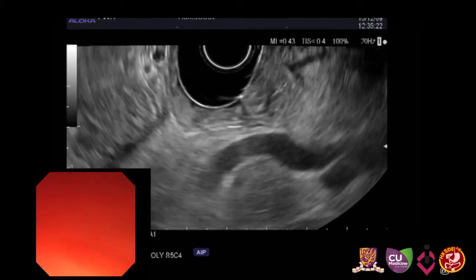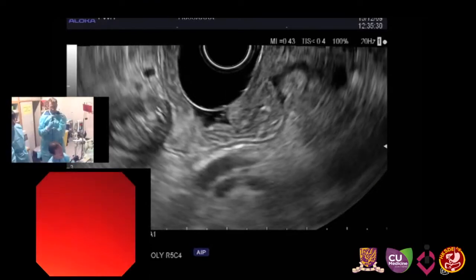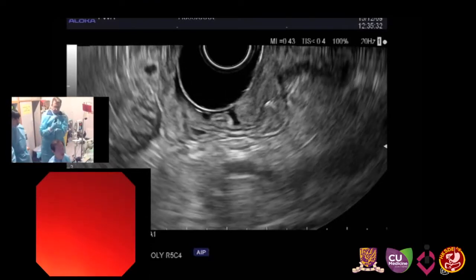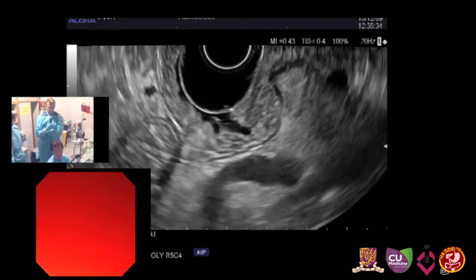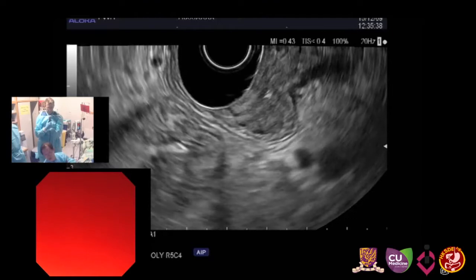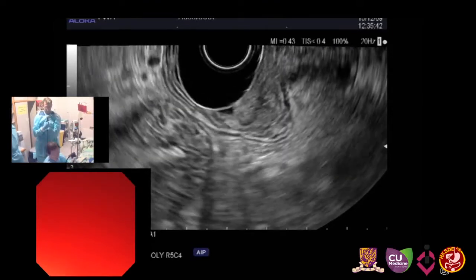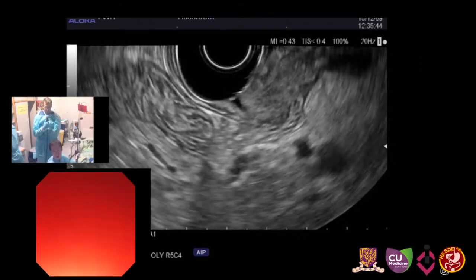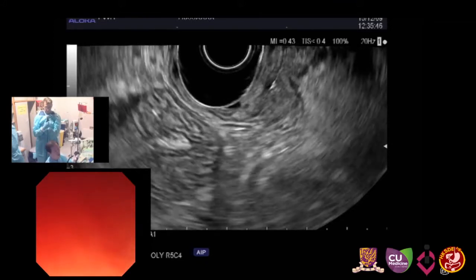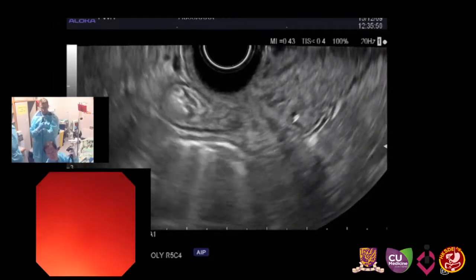Okay. Is there any question or comment on the evaluation of this lesion? Yeah, I think okay. But after resection, we need to carefully examine the pathologic specimen. Sometimes it gives some cancer focus, but if there is no cancer focus and the resection margin is clear, then I think this case can be treated just by ampullectomy. Yeah. Okay, then thank you very much.